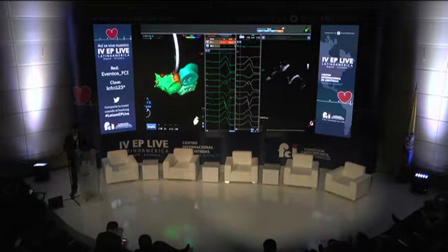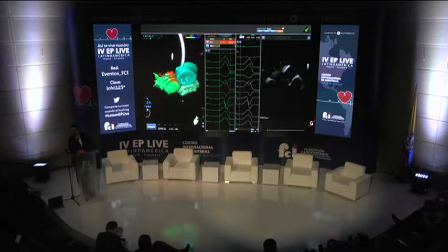That's the case for most of our EP labs. So in this type of approach, I don't have intracardiac echocardiography. We don't have, at the present time, any TEE because of our political problems. So we inject in that area before we apply. What is your opinion? How do you do it?